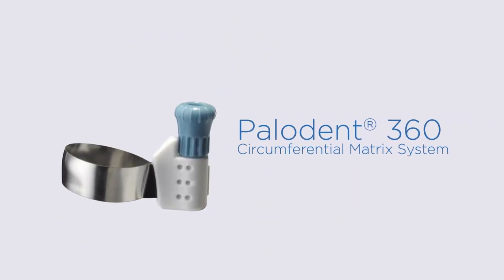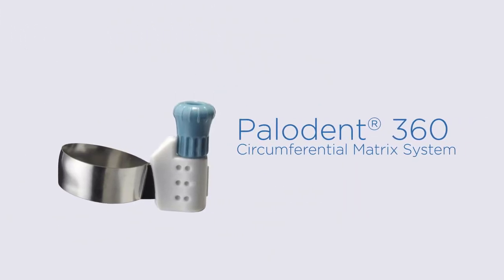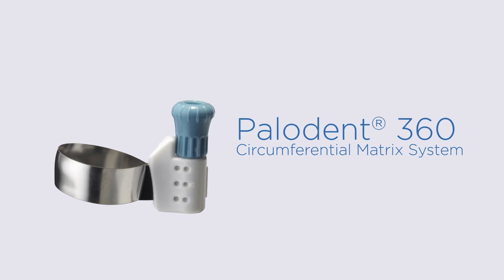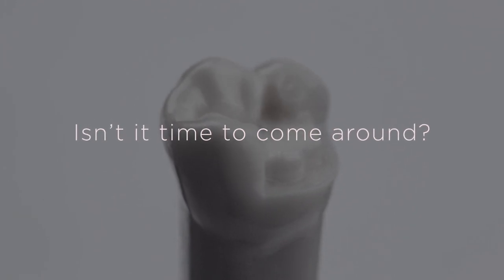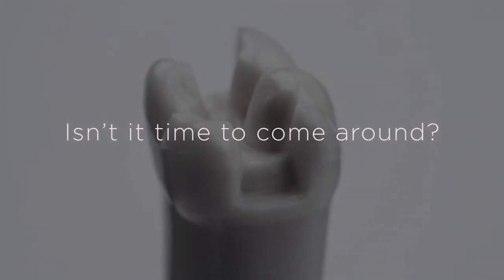Our single-use Palodent 360 system is the circumferential matrix designed to meet even your most complex posterior restoration challenges, such as when you have a misaligned tooth, no adjacent tooth, a missing cusp, or a large MOD.